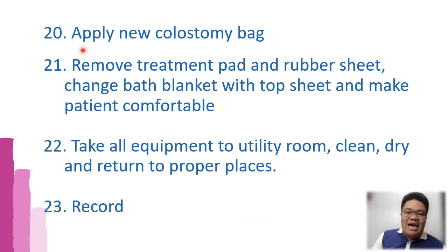Then you need to apply your new colostomy bag. And when you apply your new colostomy bag, you need to make sure, class, that the colostomy bag would fit properly on the ostomy. Class, if this is the whole of your ostomy, the colostomy bag is around that area. It is not too close, but it is not too far from the stoma.